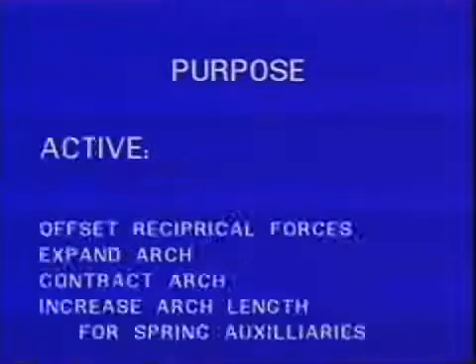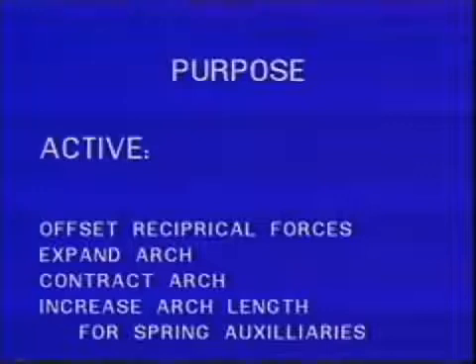The active components: offsetting reciprocal forces, the arch can be narrowed or expanded or torqued in order to offset forces delivered to the buccal surface of the teeth. The arch can be both expanded and contracted, and increases in arch length can be achieved with tipping of the various components of the arch.